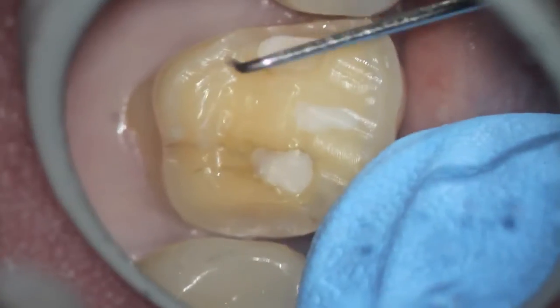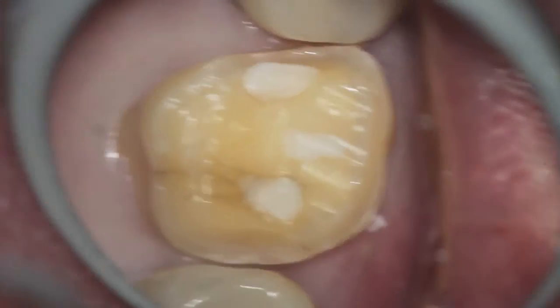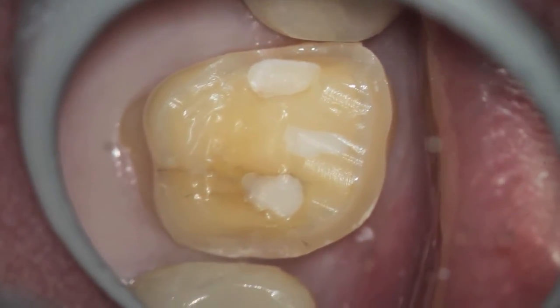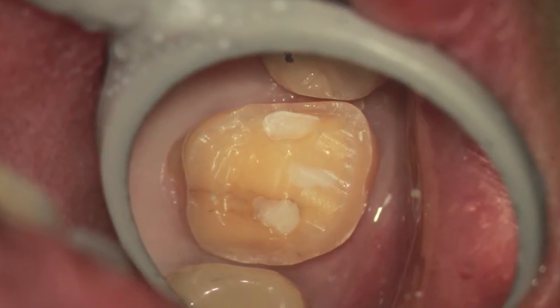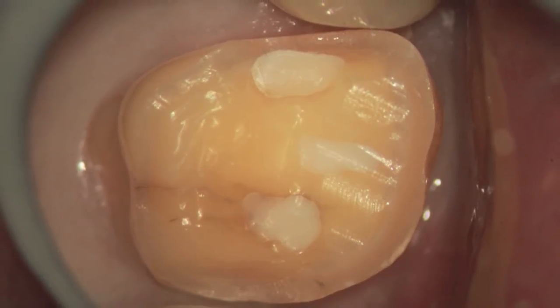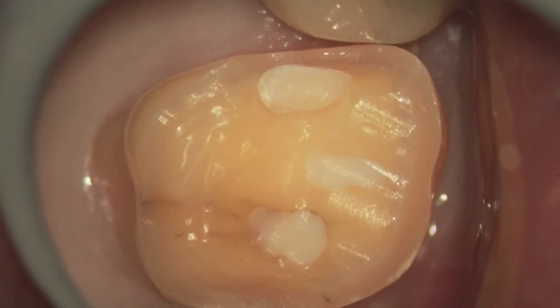We continue to remove the interproximal area, and you can see that both areas are completely done. There is a nice smooth surface so that there are no extra areas that would cause a hang-up when we place the crown. We'll be able to do this with a regular luting cement and it doesn't need to be bonded.